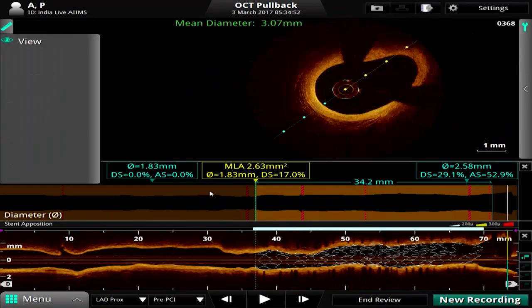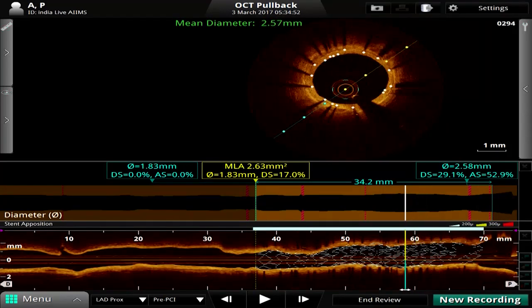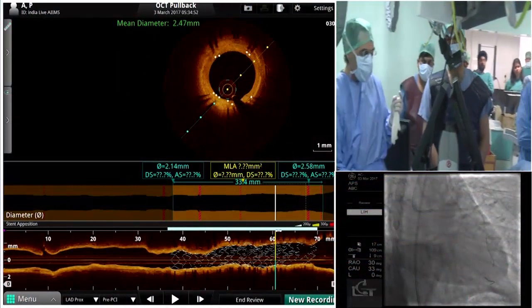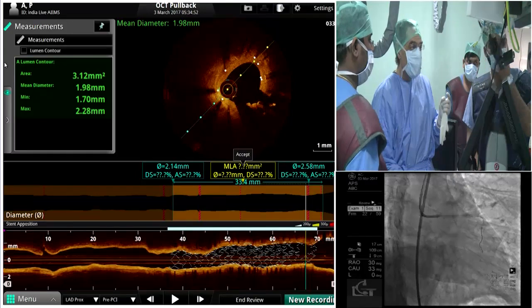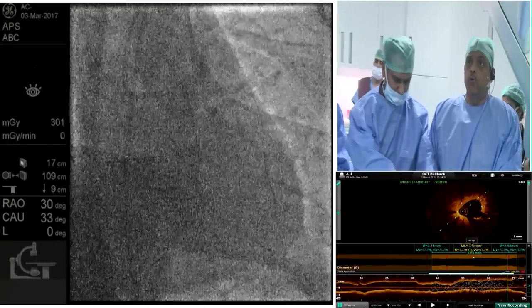And what is the size you found of the stent, Dr. G? It's 2.5, at the tightest point. Okay, so do you think we need to dilate the LAD stent also? If you look at the OCT, with a non-compliant balloon, you can see that at the level of the bifurcation there is a reduction of the lumen. So I think we might need some supplementary dilation here, because at this point the lumen is very small. Okay, can we go back to the angio now? We'll go back to angio now, and we have 2 wires placed.